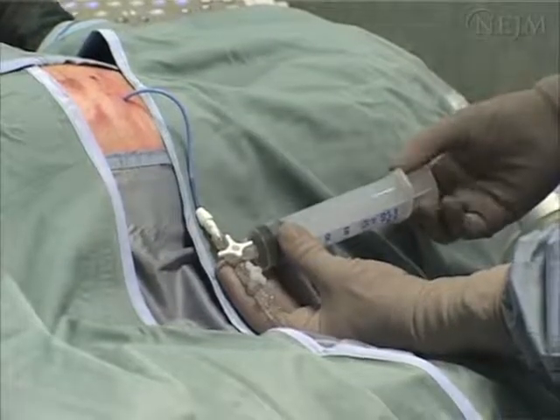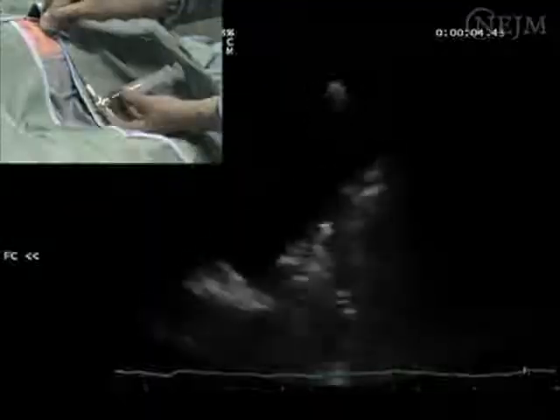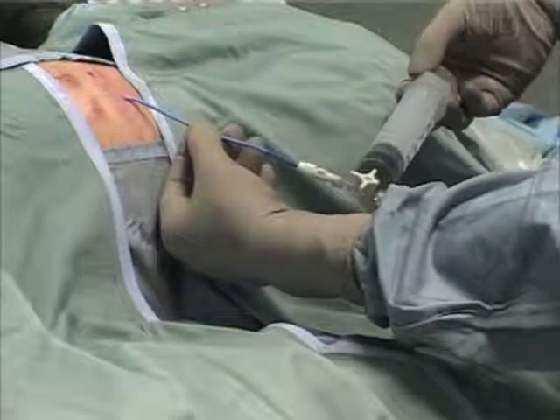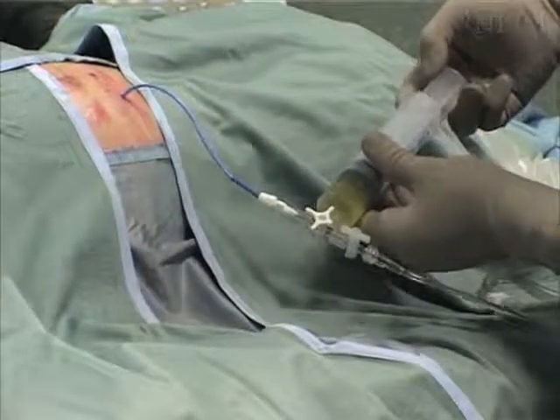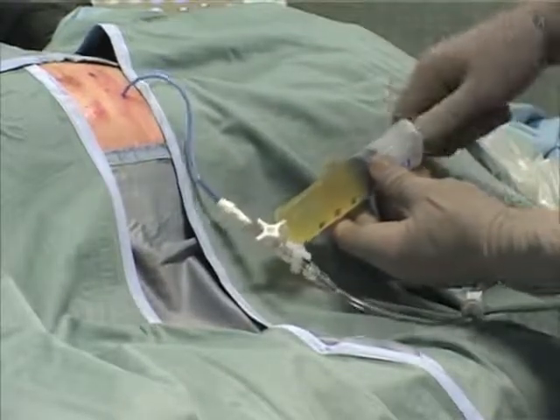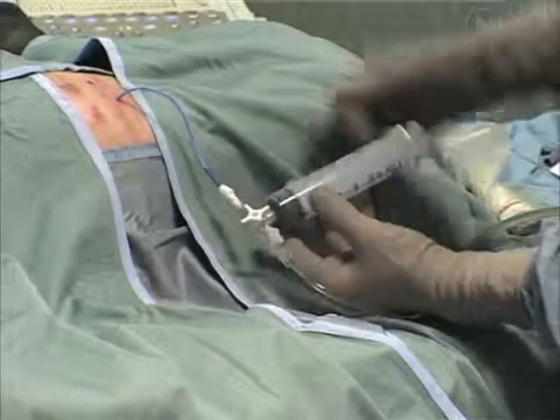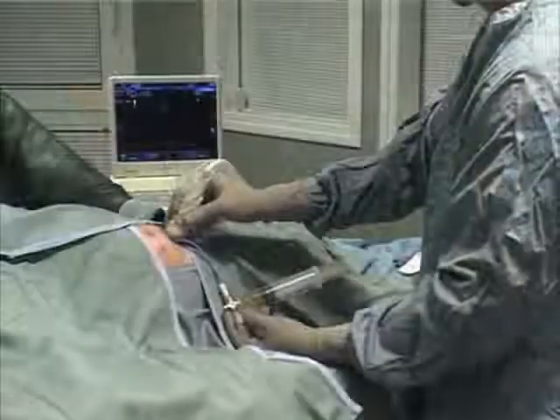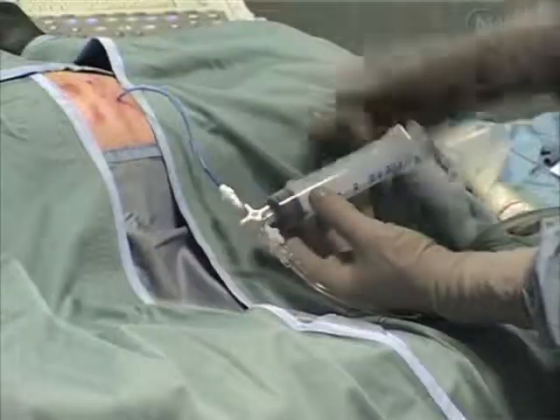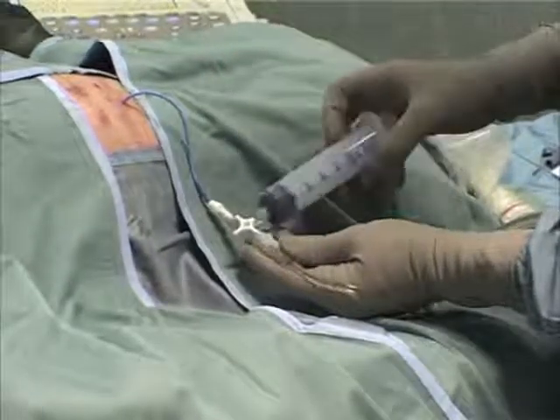Before securing the catheter, make sure that all the fluid has been drained and that the effusion can no longer be detected with ultrasonography. If you see residual pleural fluid, slowly pull the catheter out by a maximum of half its length and begin to gently aspirate the liquid with the syringe, draining fluid as far as possible without feeling resistance. Repeat this procedure until the residual fluid has been removed. Be sure not to withdraw the catheter too far; the curled end and its perforations should remain within the pleural space. If there is no residual fluid, disconnect the syringe and leave the stopcock open to allow flow from the patient to the collection bag.